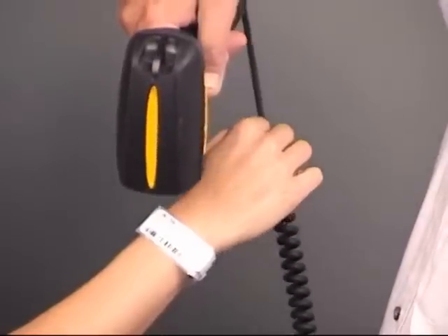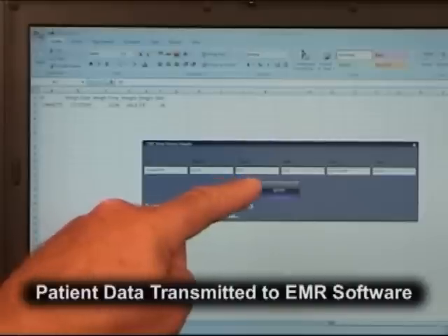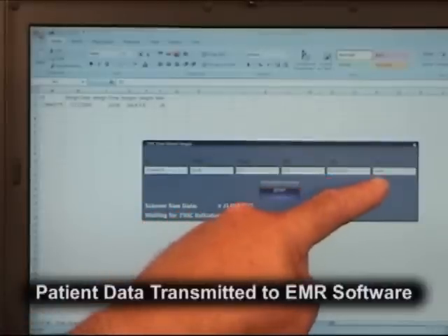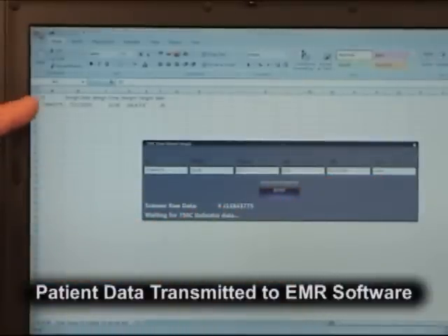Detecto can scan and record the patient's identification, and then transmit all weight, height, and body mass index directly to the desktop PC or even your network. As shown here, the computer has received all of the patient information automatically and has recorded it within a standard Excel report screen.